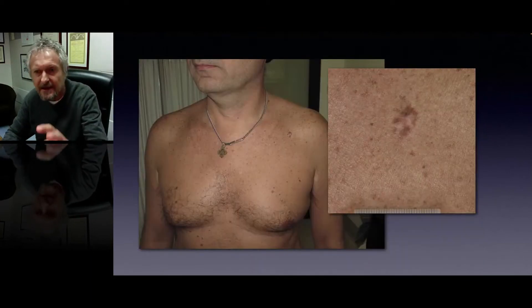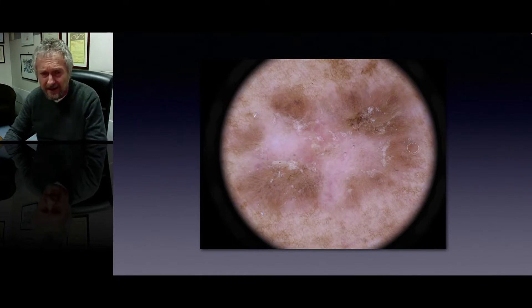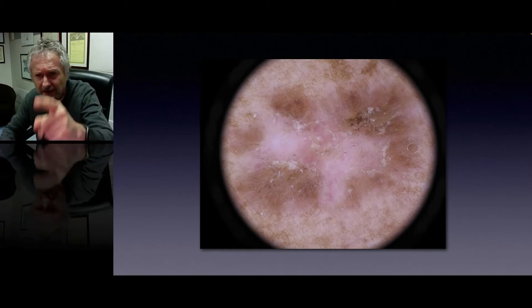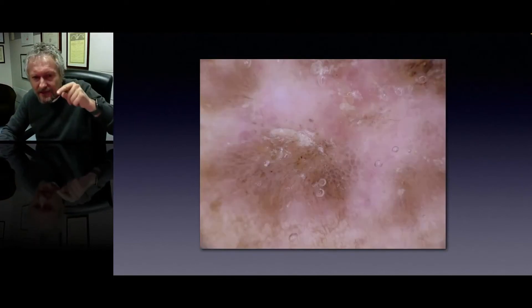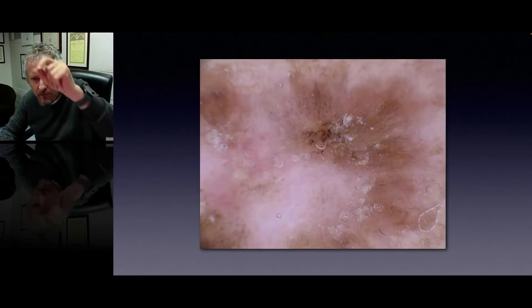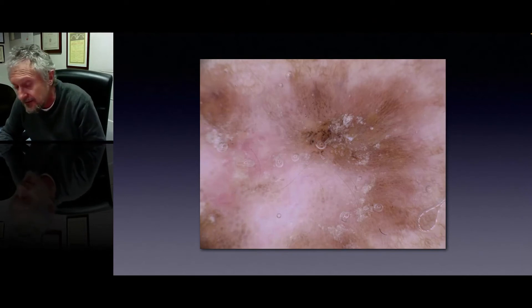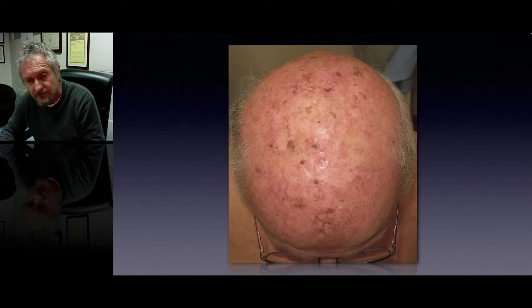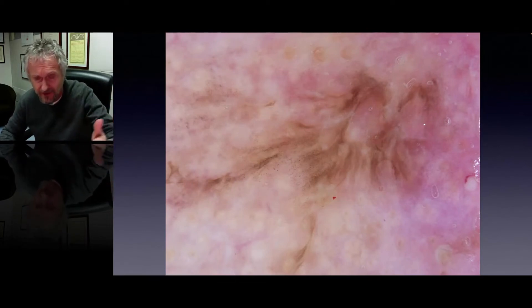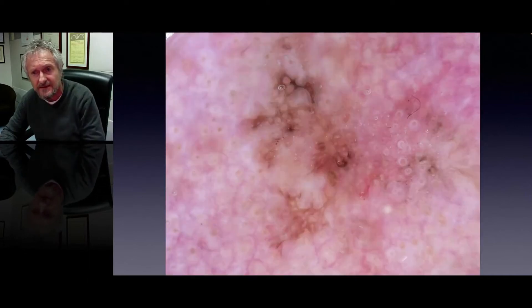Here is an example of a pigmented Bowen's disease which clinically looks clearly like a melanoma. But if you look carefully in the dermoscopy, apart from a white area that really looks like regression of a melanoma, at the periphery you see lines composed of dots or globules in a line. This is perhaps the only specific clue for the diagnosis of pigmented Bowen's disease. Here is another example of a Bowenoid actinic keratosis with pigmented lines in the periphery.